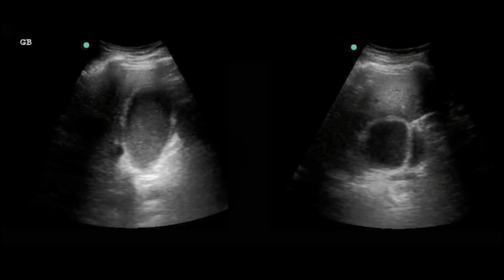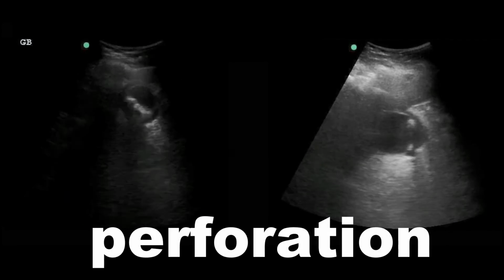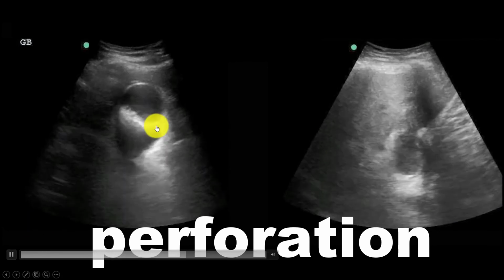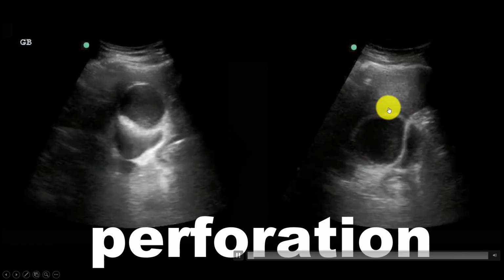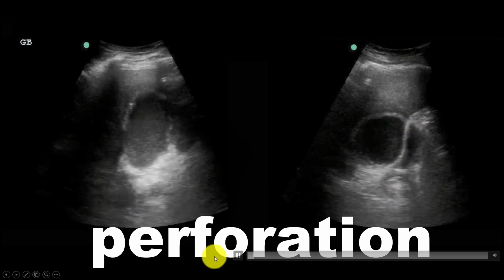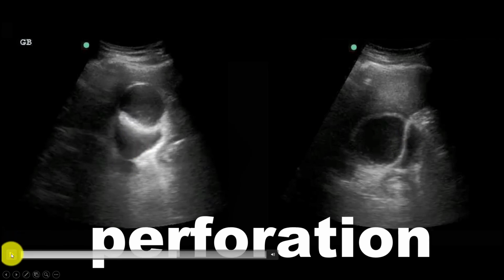Here's another example. So this is actually a patient with a perforated gallbladder from cholecystitis. Again, you're seeing kind of this sludge in the gallbladder itself, this pretty significant amount of paracholecystic fluid, which you see actually pretty nicely here on the short axis view. And then last is you see kind of this large fluid collection outside of the gallbladder. You see it in both views here, but that is indicative of gallbladder wall perforation.